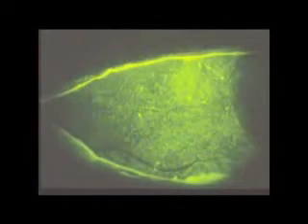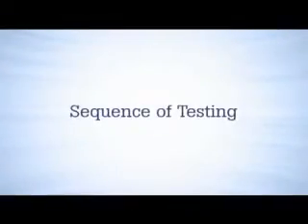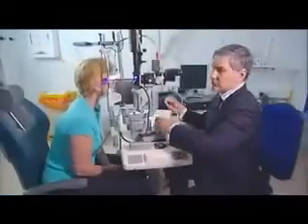In contrast, in this patient with severe dry eye, viewed through a yellow filter, you can see extensive fluorescein staining of the exposed conjunctiva. Sequence of testing. In this demonstration, you will see the following sequence. 1. Using fluorescein to measure tear film stability and to grade staining on the cornea and conjunctiva. 2. Using lissamine green to grade staining on the conjunctiva alone.